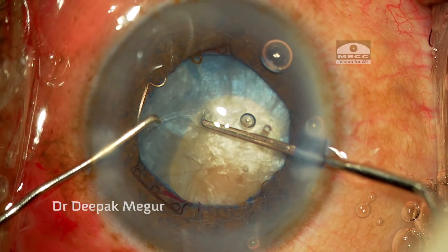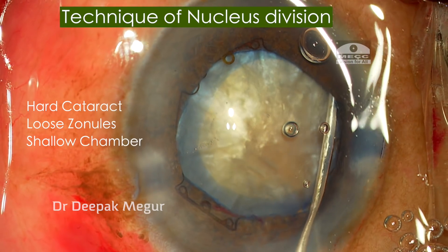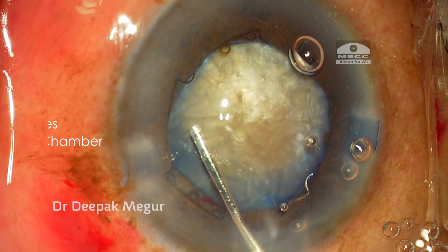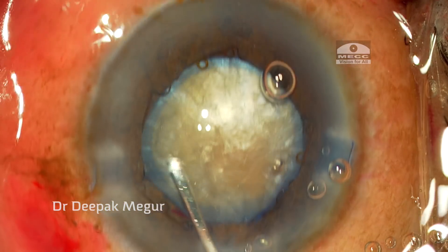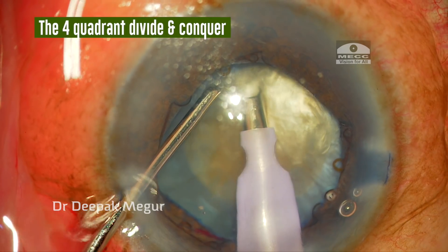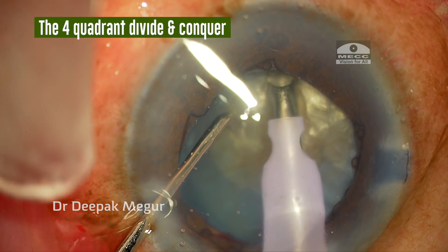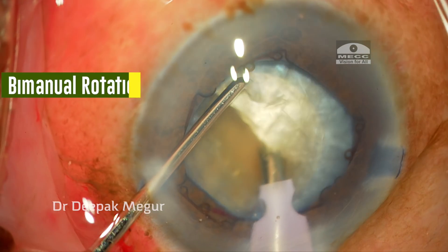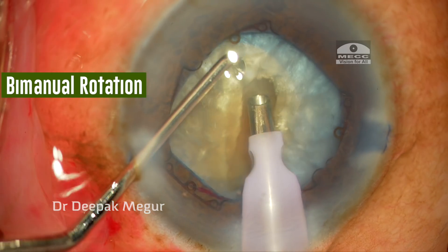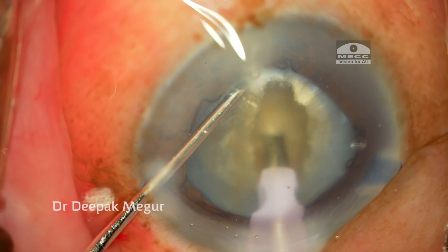The next thing to consider is the technique of nucleus division, since we are dealing with a very hard cataract with loose zonules and a shallow anterior chamber. Although my usual technique is the direct chop, in this case I decide otherwise. I am planning to use a four-quadrant technique, hoping that it will minimize the stress on the zonules. The majority of the power is being utilized in the bag itself. While rotating the nucleus I use a bimanual technique, pressing the nucleus down with my sharp chopper and with the phaco probe I gently rotate the nucleus — again minimizing stress on the zonules.